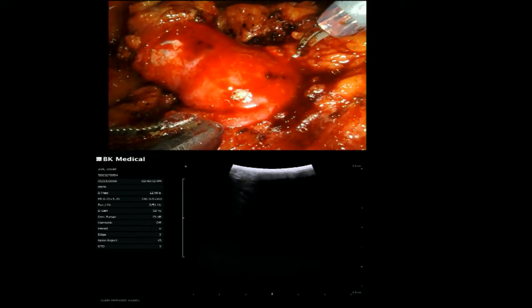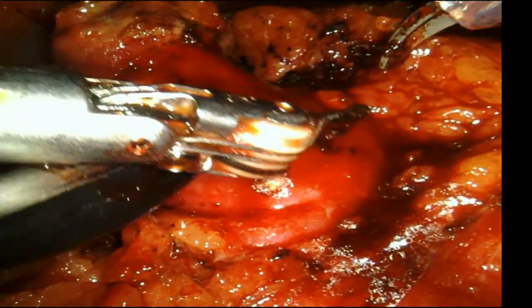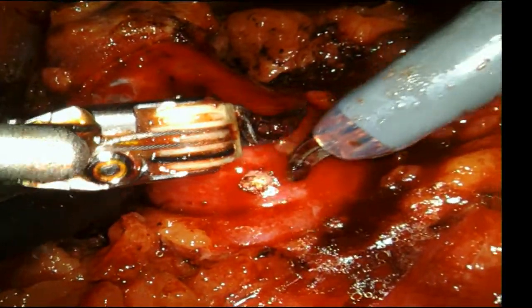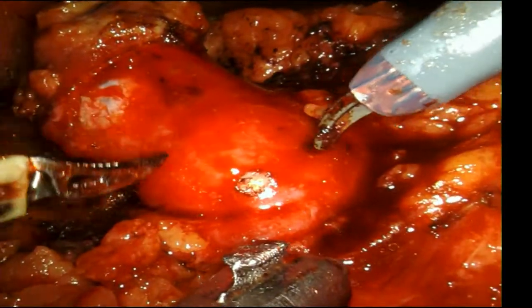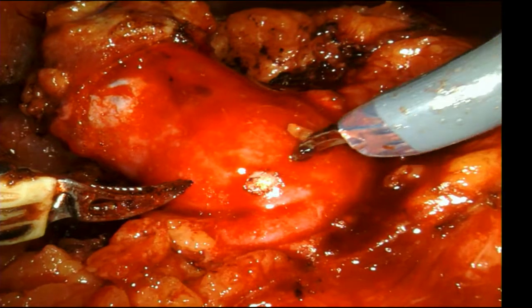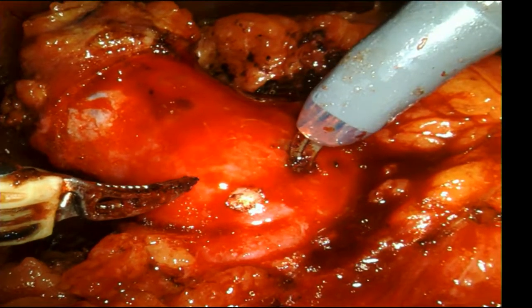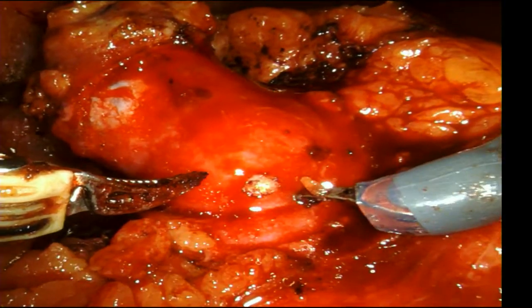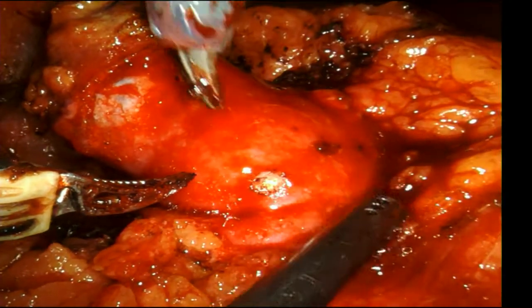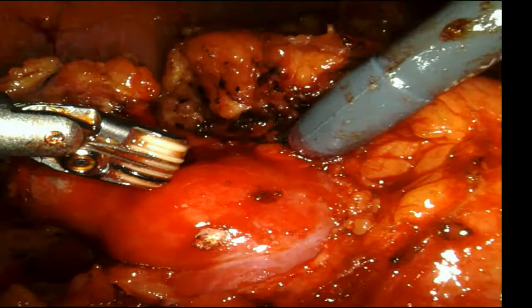Yep. So it's the combination of the sweep. So you sweep the probe over until you don't see the tumor anymore, and then when you get to the area where you're planning to cut, you just rotate the head, and that tells you the direction of the cut. So in here, I'm not going to cut this way. Here, I would get into the tumor. If I'm going to cut here, I got to cut this way a little bit. Now, if I was over here, then yes, I could cut this way. If I was over here, then I'd have to cut much more this way. So you kind of use the two cues with the ultrasound to figure out where to go.